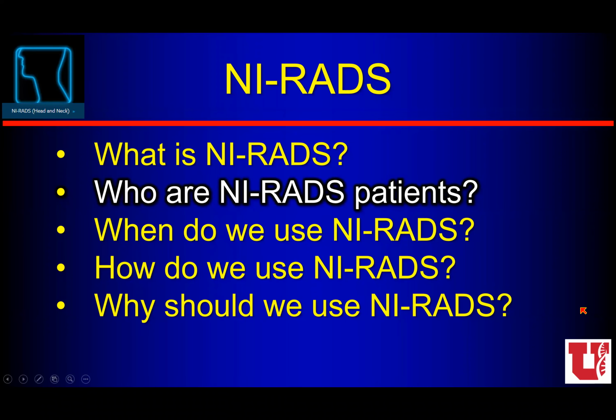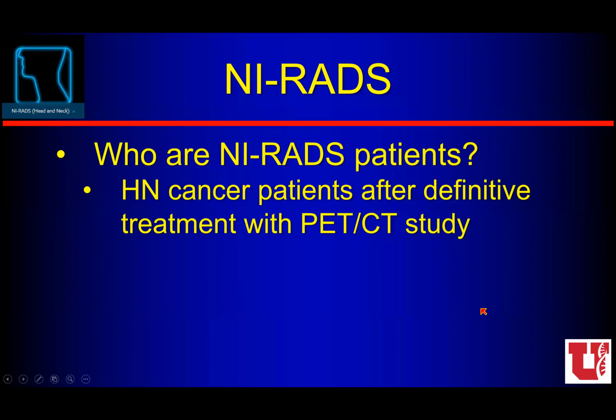So who are the NI-RADS patients? These are head and neck cancer patients after definitive treatment with a PET-CT study. So they've already had definitive treatment, whether it's chemo, surgery, radiation, chemo-radiation, whatever combination it is, and they have a PET-CT. So that's obviously going to limit the patients that we use. I thought we should be trying to use NI-RADS on everything independent of modality and pathology, but I was voted down. It was very sad.